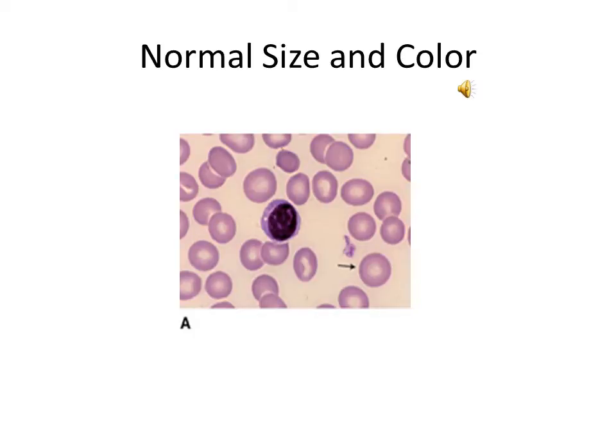Here you see a normal size and normal colored RBC. The arrow is pointing to it so you can see it in relationship to the small lymphocyte, which is the white blood cell in the center of the screen. You can also use your differential to help you discover that you have a normal size and color red blood cell population by using the MCV and the MCHC.